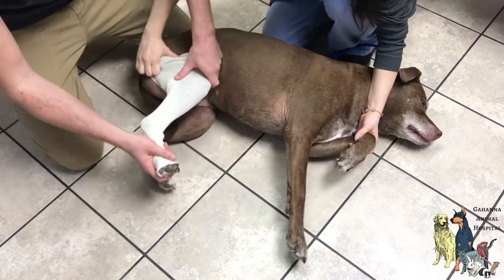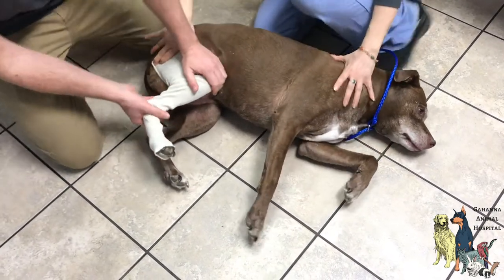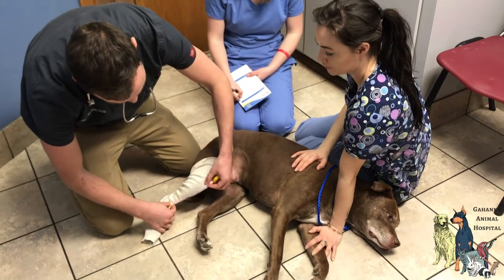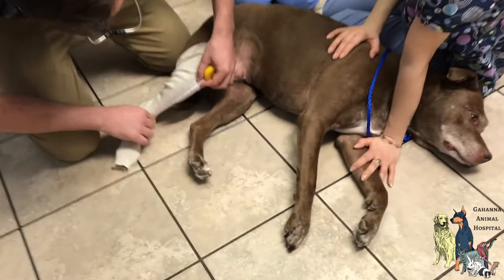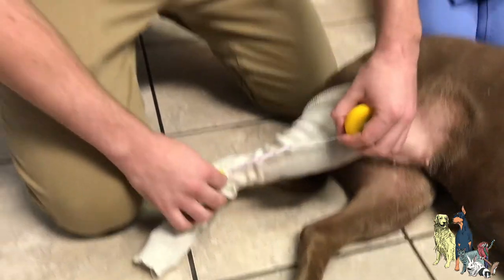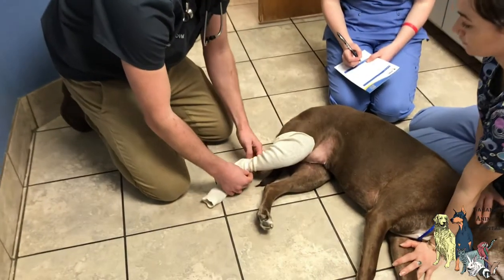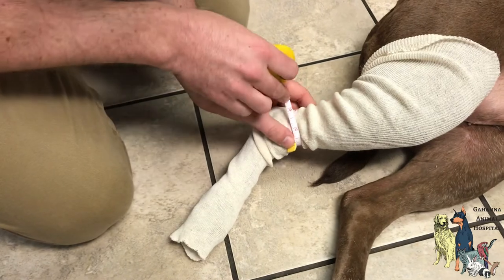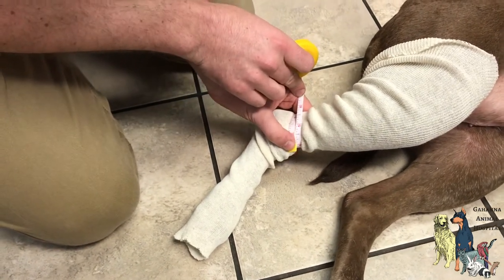Our next step is to take a measurement once the stockinette is on. We're measuring the tibial crest right here to the cranial hock for the brace, and it appears to be six and a half inches. The next measurement is circumferential around the calcaneus, which is right here, and that measurement is about four and a half.